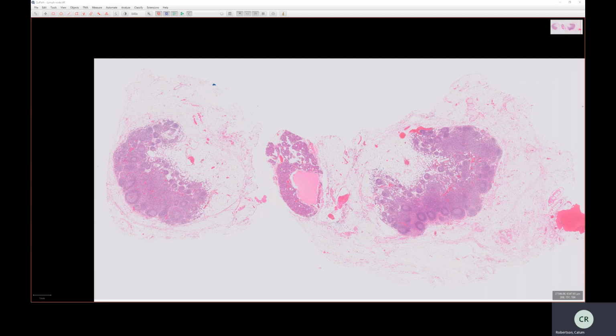However, the majority of the time you will be dealing with lymph nodes as part of your surgical practice, and that's when dealing with carcinomas, and you're looking at lymph nodes to see if the carcinoma has spread to the lymph nodes. In those circumstances, the details of the lymph node architecture, etc., is probably going to be less important, and really what you're doing is screening the lymph nodes quickly to see if they've been involved with carcinoma. So this video, we're going to have a quick overview of lymph node histology and architecture.